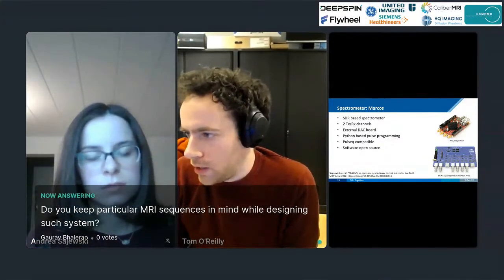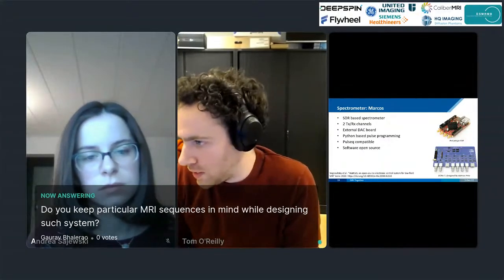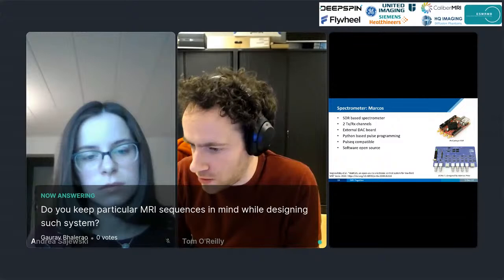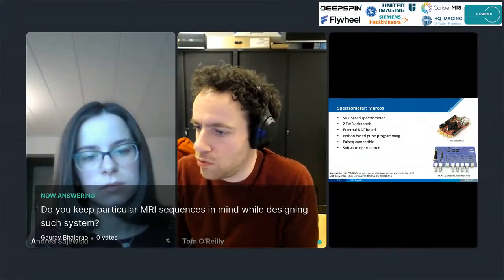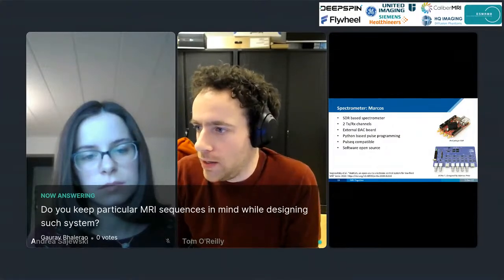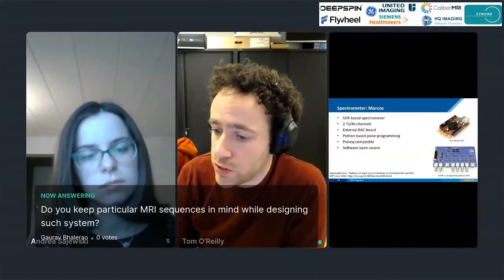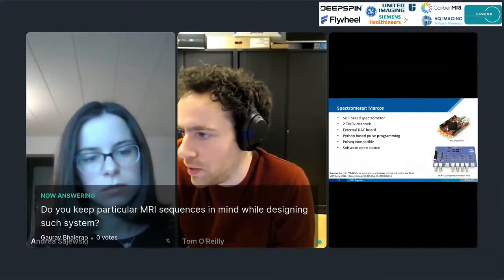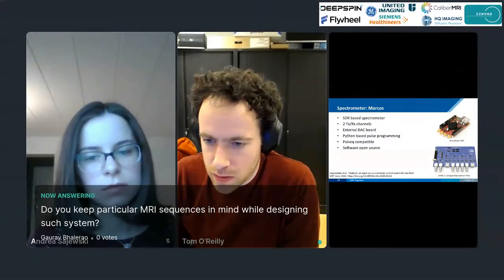You can run a gradient echo, sure, but if you really want to do fast gradient echo imaging, so you want to go towards the steady state free precession, the SSFP sequences, those SSFP sequences need line widths on the order of hertz. And you have to drop the field strength of your system so much in order to even get close to those line widths that it's just simply not worth it to do conventional SSFP sequences.